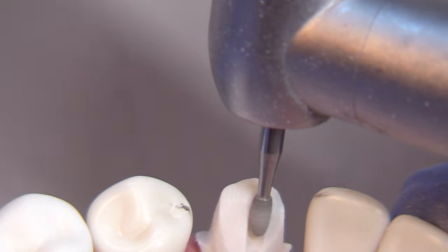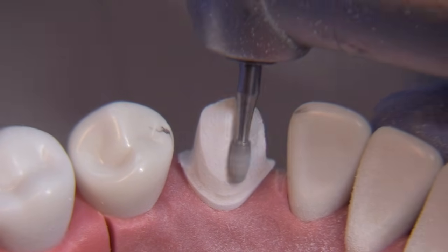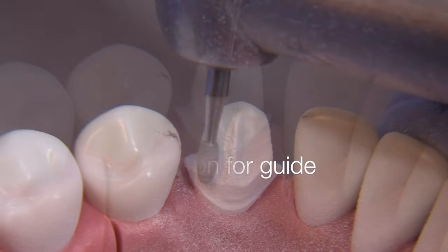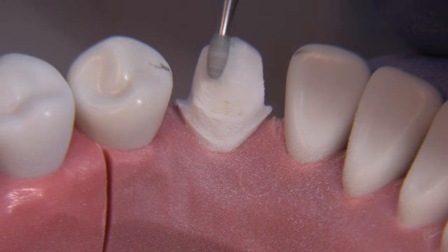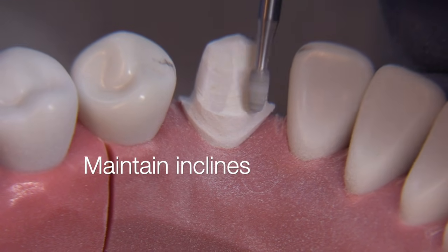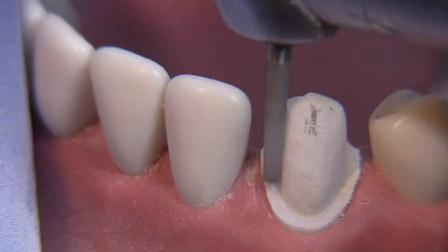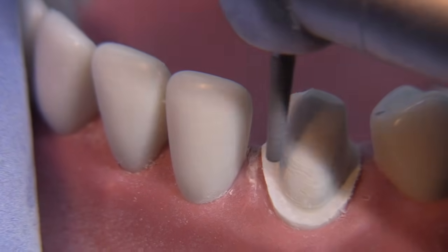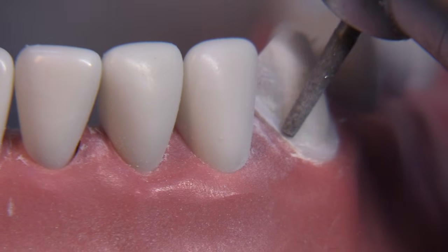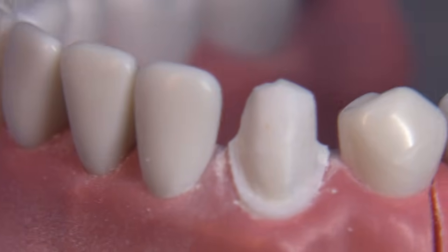A football-shaped diamond, the 379-014, is used for the lingual inclines. Using half the diameter of the bur — that's 0.7 millimeters — gives a really good amount of reduction for the metal in this area. If you need porcelain here, reduce just a little bit more, up to a millimeter. This area is not in function but needs room for ceramic, metal, and the opaque layer. I like to maintain the morphology — keep the inclines — and refine with fine diamonds at slow speed or around 5,000 RPM, even as low as 500 RPM, with the bur tip perpendicular to the unprepared surface. Always remove any undercuts after shoulder enhancement.